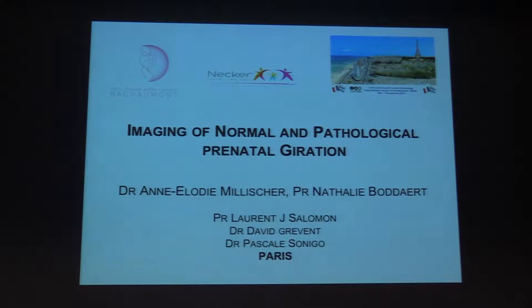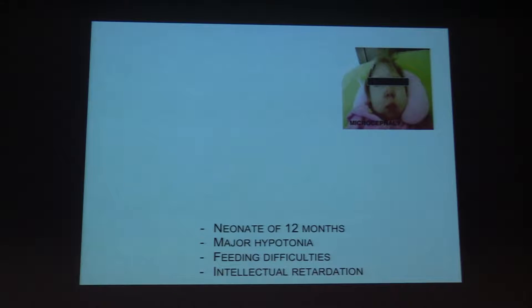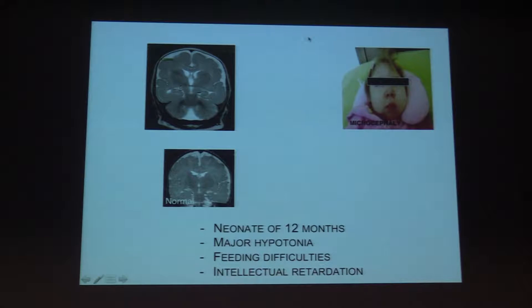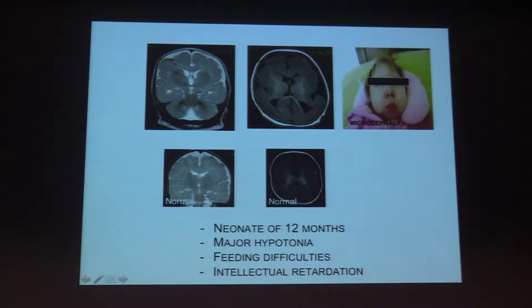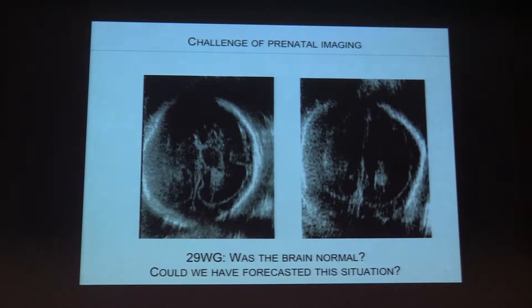To begin, here is an unfortunate case of a little girl aged 12 months who presents with major hypotonia, feeding difficulties, and intellectual retardation. An MRI was requested. Here is the MRI of the little girl alongside a normal MRI at her age. You can see that regarding the cortical aspect, this MRI is completely abnormal.